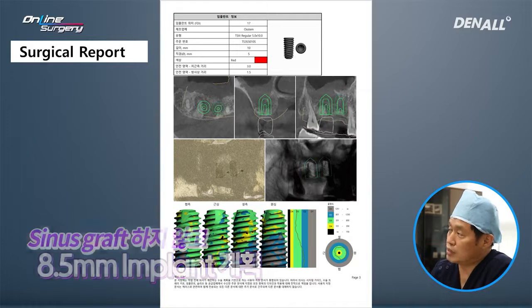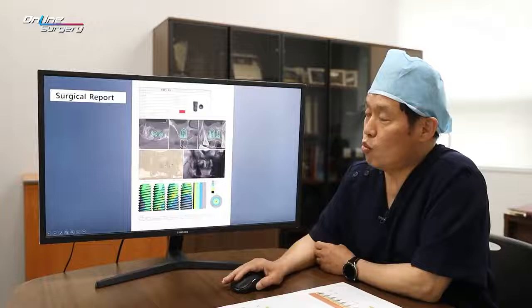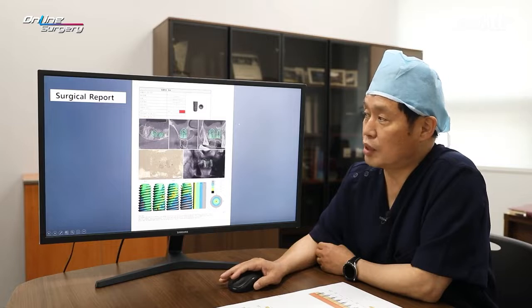As mentioned earlier, in the past, there was socket preservation and bone graft was done. Bone graft material can be seen in the posterior area. The bone seems to be harder because xenograft was used. In order to prepare for sinus floor penetration, the OneCAS drill was determined to be used for the surgery.